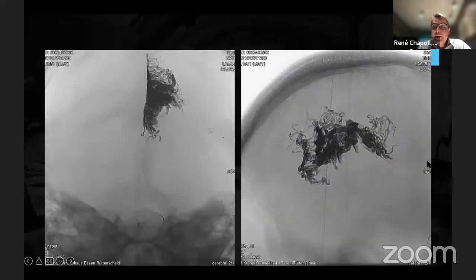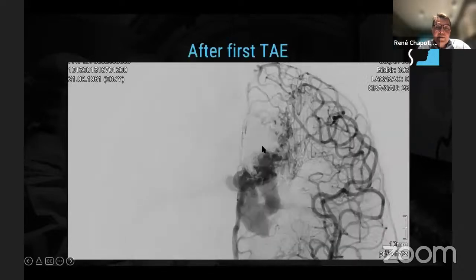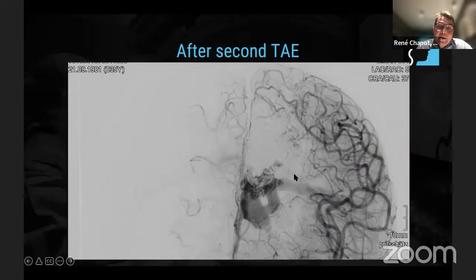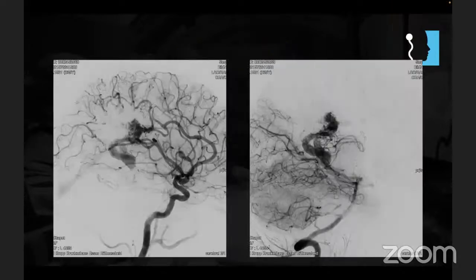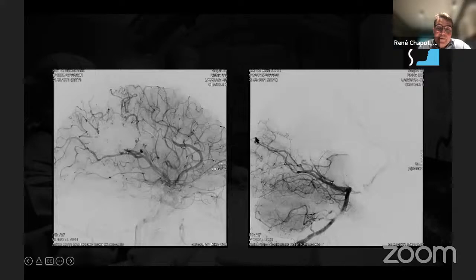And this is what we could do here in this patient. You see that this is the single feeder where all the corresponding shunts were done. So this is before and after step 1, and in a similar way, after step 2. Now the rest is just that you have the vein, which is well accessible, not too many arteries, so the risk of getting here transvenous is not too high. And here, by getting transvenous, you can cure this AVM.